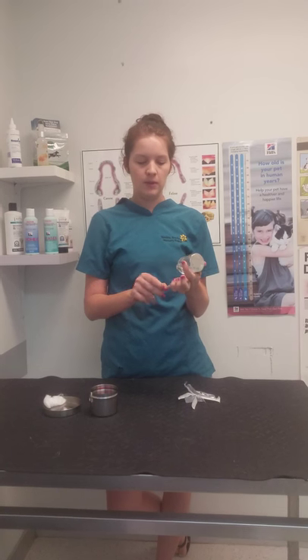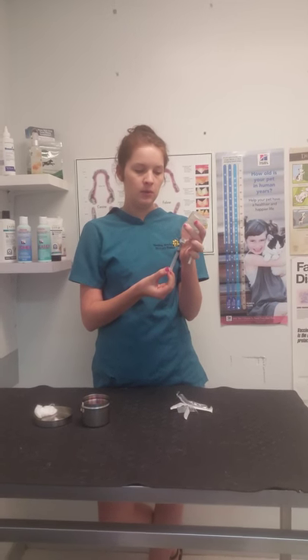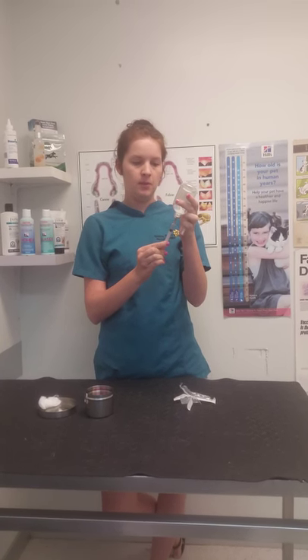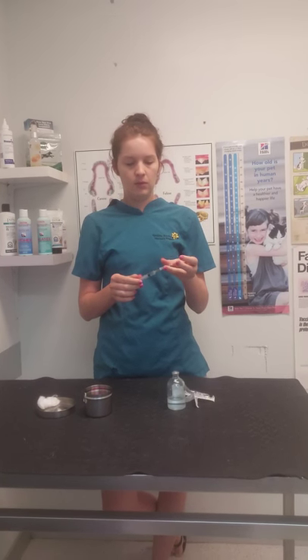We can then turn the bottle upside down, place the syringe and the needle into the bottle, drawing back until we've got the desired amount for the draw, and recap.